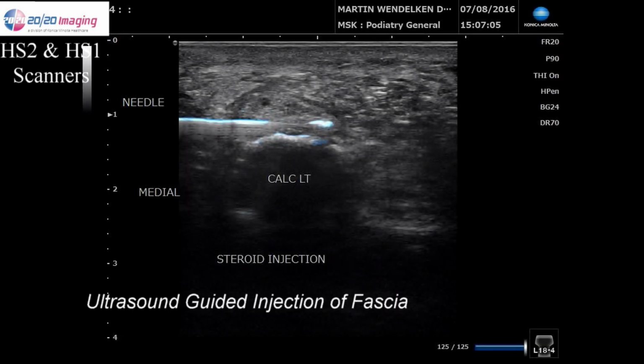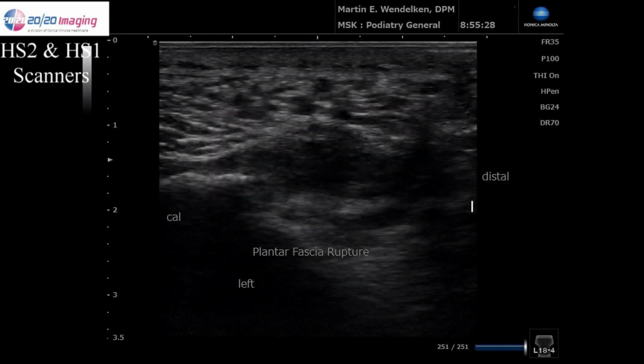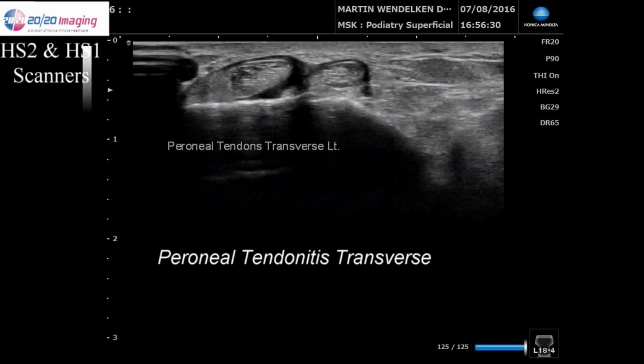Here I'm showing you injection of the plantar fascia transversely. The next image is a plantar fascia rupture. Notice it's just disorganized and chaotic. Here's a nice image of a tendinitis. Note the fluid on the tendon.